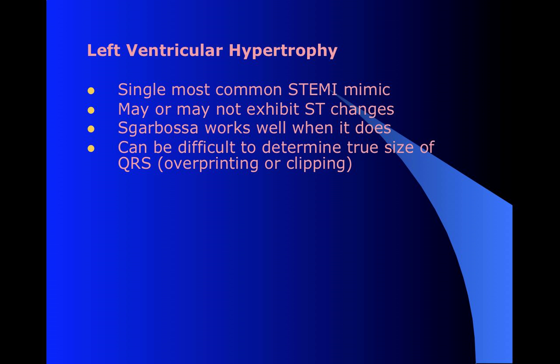And you can tell because instead of coming to a point, as any wave normally should, there's a square edge to it. So you might be saying, well, I don't know how deep this really is. It's hard to tell exactly how much elevation I can have. That can be tricky. Life packs will do that if you're on the edge of the page, but in most leads they will just overprint, which can also be hard to read, but it's usually a little bit easier to work with.